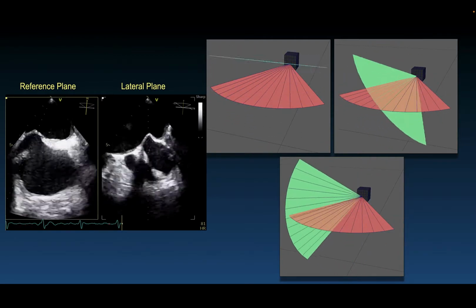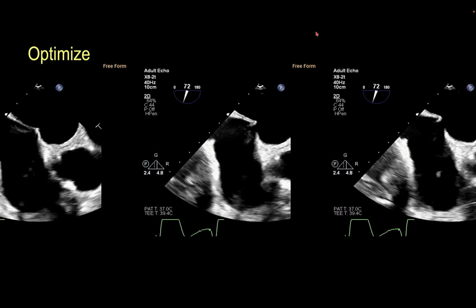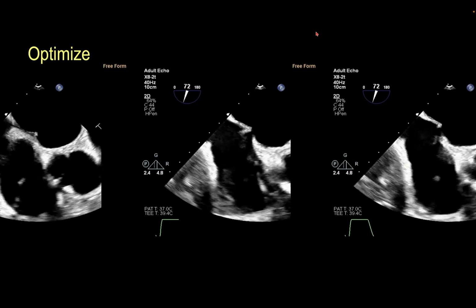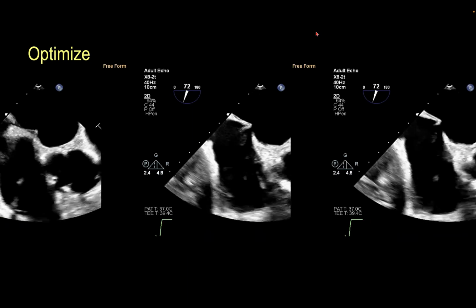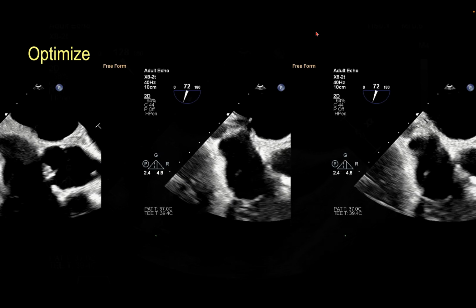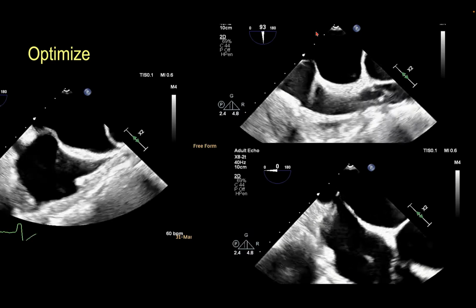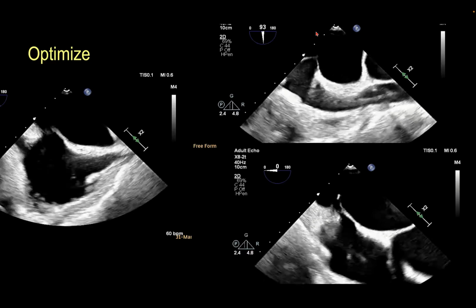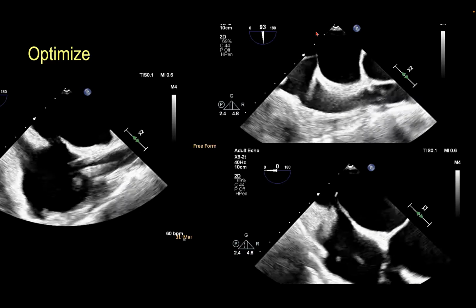Okay. So anyway, moving on, once we've located the image, next we go on to optimize the image and the location. Like in this patient, you can see that the needle in the leftmost image is a little bit more anterior than we would like it to be. The needle has gradually shifted in real time, under real-time guidance, from the anterior to the posterior margin of the fossa ovalis. While we had done this in the anteroposterior location, in the optimization we go back to the bicaval window again and confirm that we have not changed our location in the bicaval window, and see that the transseptal puncture in the supra-inferior margin is still exactly in the right location.